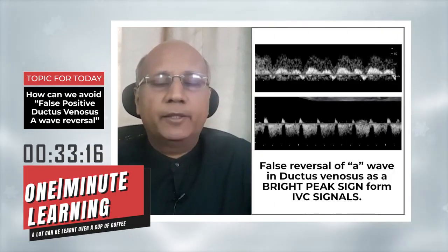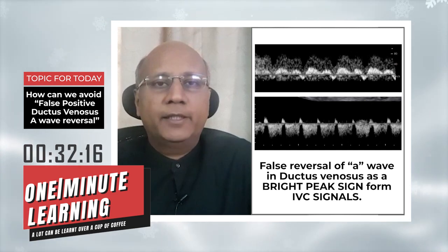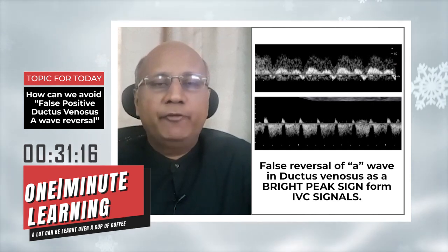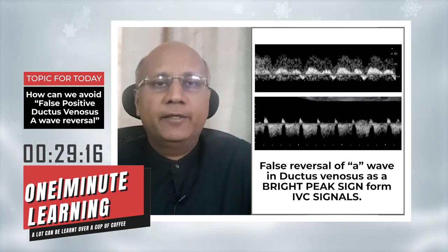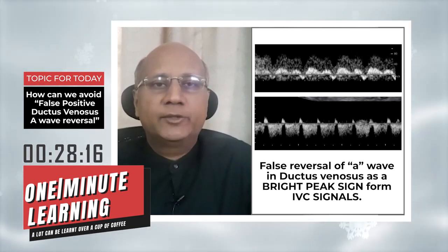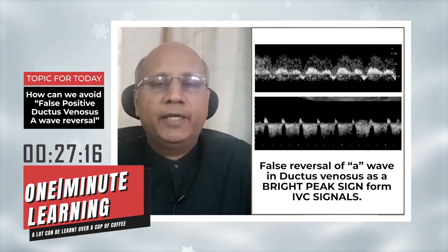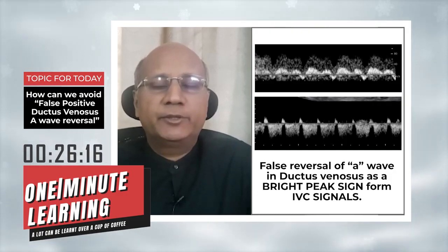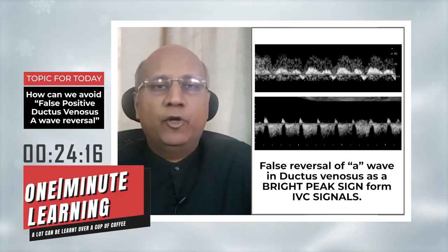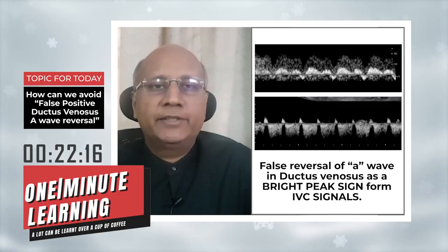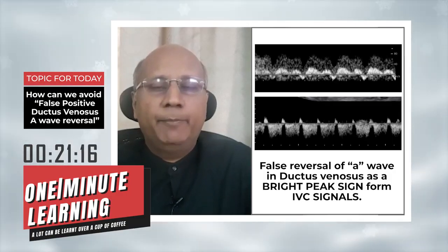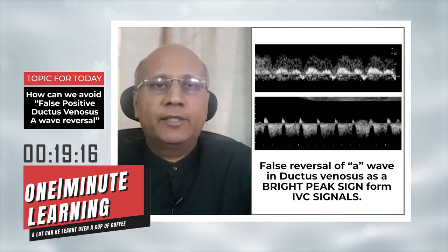Look at this Doppler. The ductus venosus waveform is gray in color and the superimposed IVC waveform is bright in color. So the normal A wave reversal of the IVC appears as an A wave reversal of the ductus venosus.